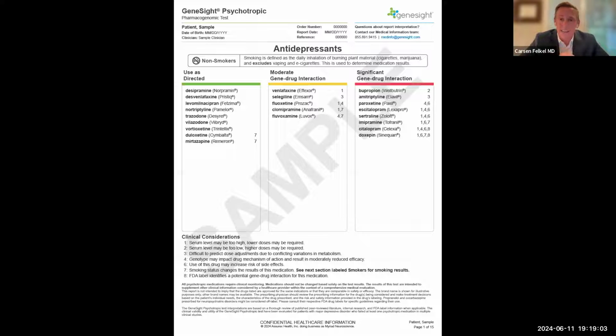It is unlikely, though, that the patient has a problem at 3A4. 91% of patients are extensive normal metabolizers at 3A4. But I'll tell you, Rachel, I've seen a whole lot of intermediate 3A4 metabolizers lately. It's only 9% of the population, but I've been seeing a lot of it. And that, of course, would change the results.